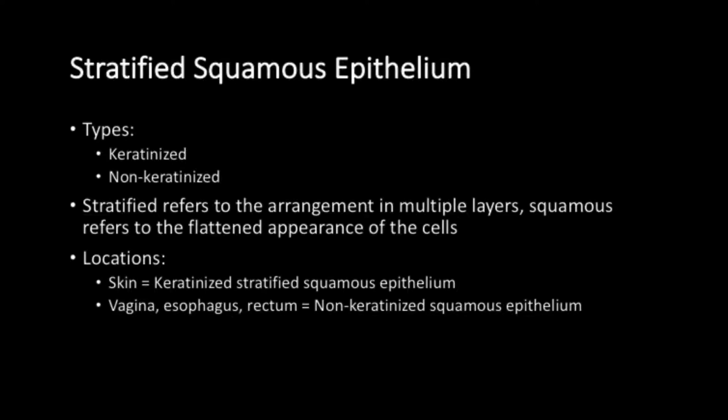So with epithelial identification, you must first find the lumen to identify the apical layer before assessing the shape of the cells. If the cells also possess large quantities of keratin, other identifying characteristics are present. Stratified squamous epithelium is found in areas that experience abrasion, as the many layers allow it to stand up to a lot of abuse. This includes places like the skin, mouth, esophagus, rectum, and vagina, among others.